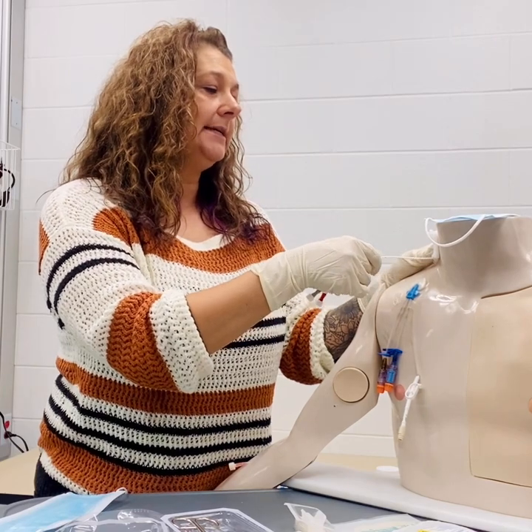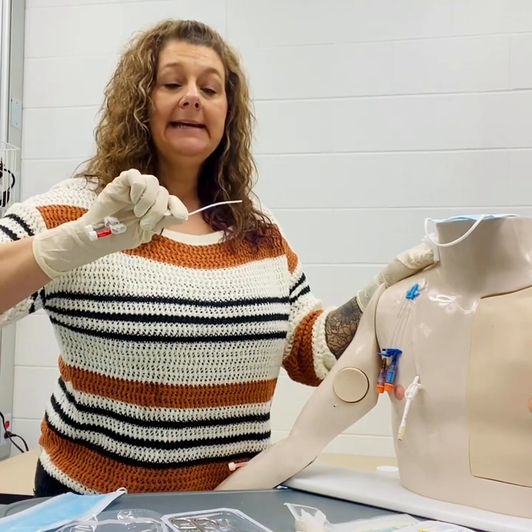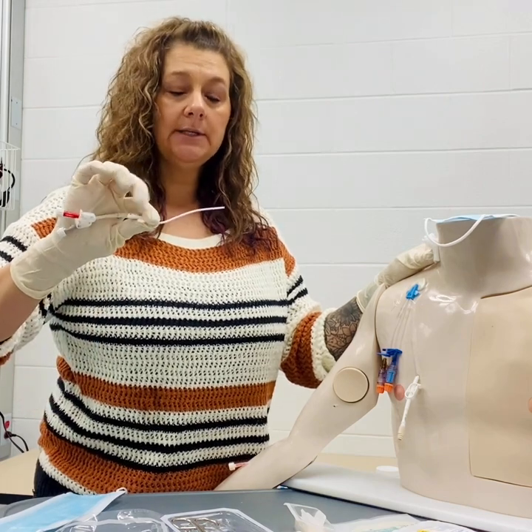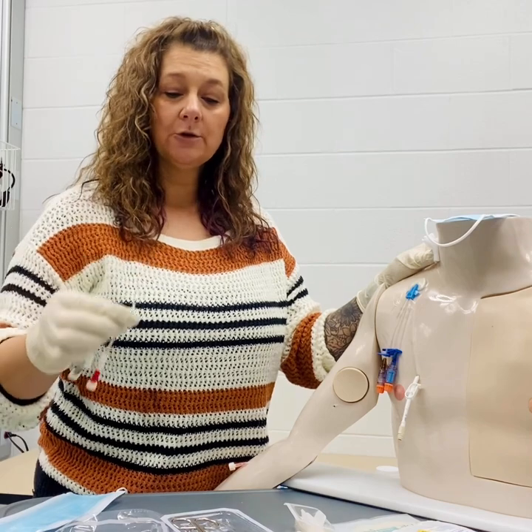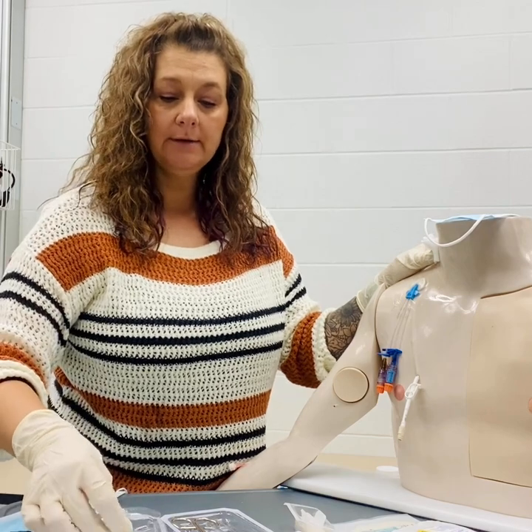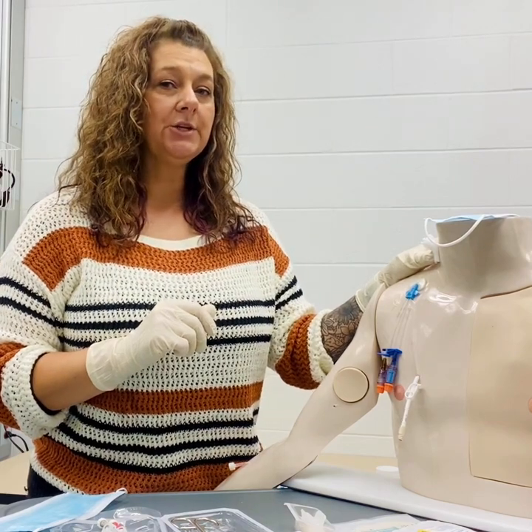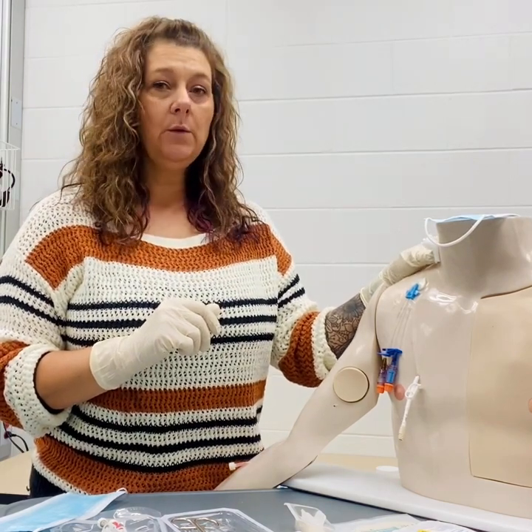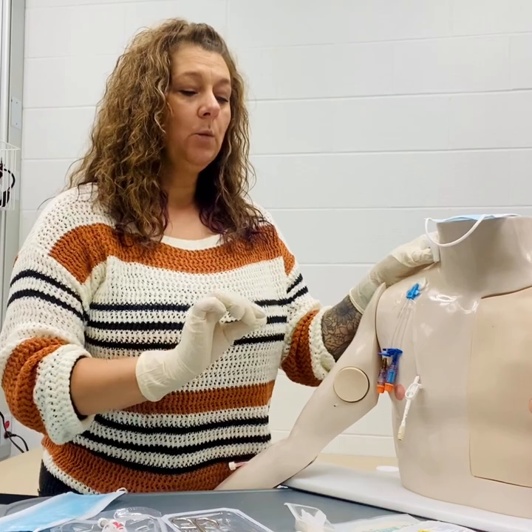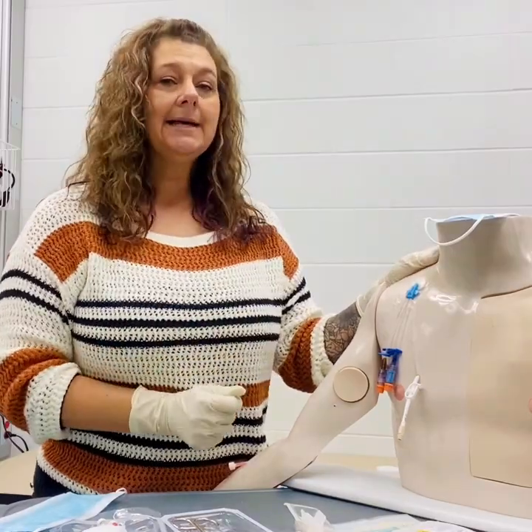Once that catheter is out, we'll inspect the tip to ensure that everything is intact. If you needed to get a specimen, you would at this point take sterile scissors and clip the tip of the catheter into a sterile specimen cup to send to the lab. We'll throw this into your biohazard bin and continue to hold pressure on the site until the patient has met hemostasis and there are no signs of bleeding. Then we will apply a new sterile gauze with a Tegaderm or transparent dressing over. We'll date, time, and label this.